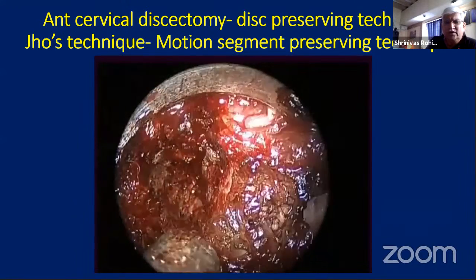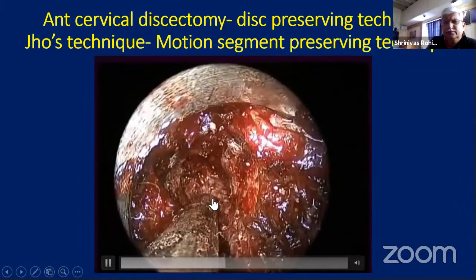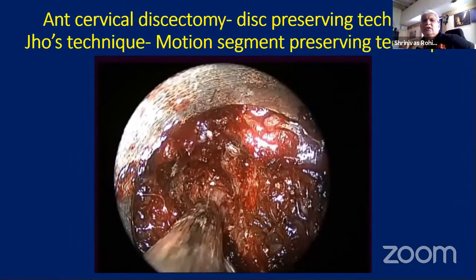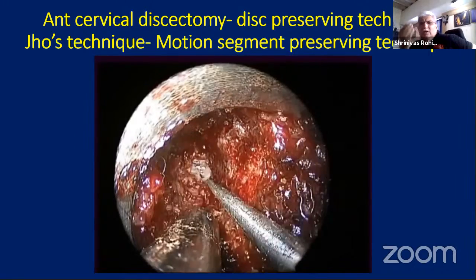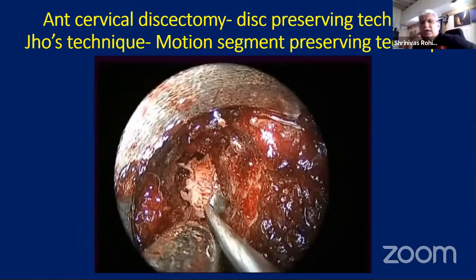Now this is the extruded fragment of the disc. So this is a disc preserving surgery. You get a very nice vision, mobility also. You can angulate according to the direction of the disc space. Now this is the disc in the anterior cervical.